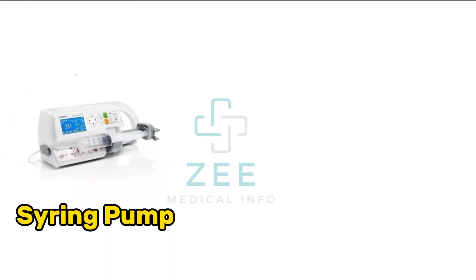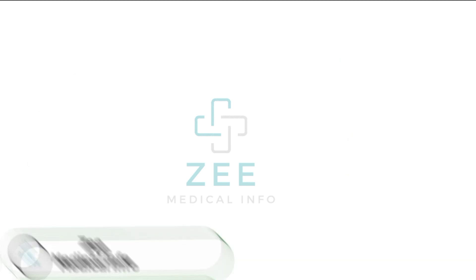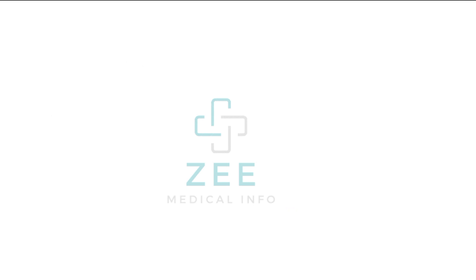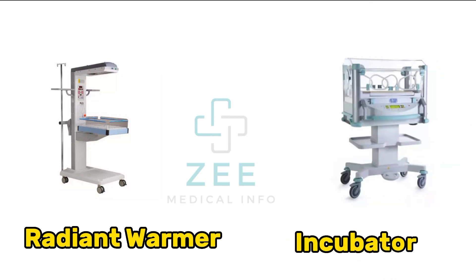Syringe pump, infusion pump, inline manometer, breast pump, radiant warmer, incubator.